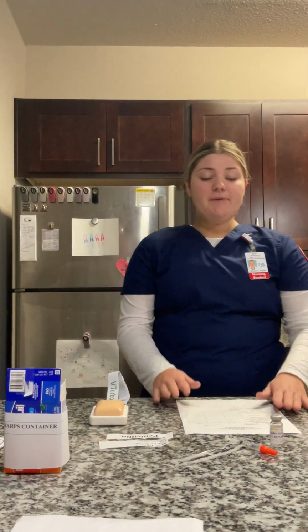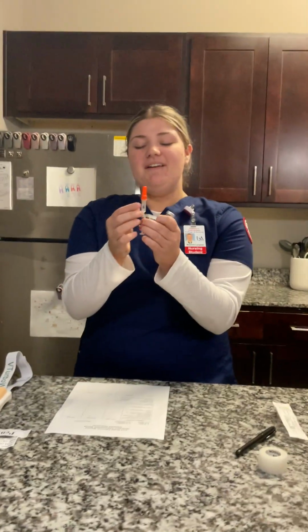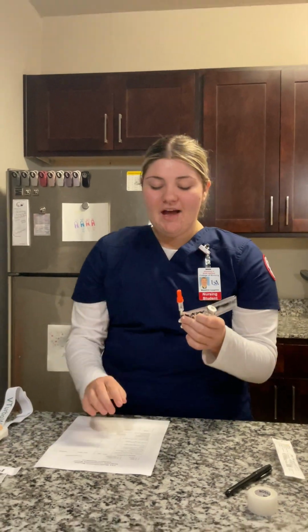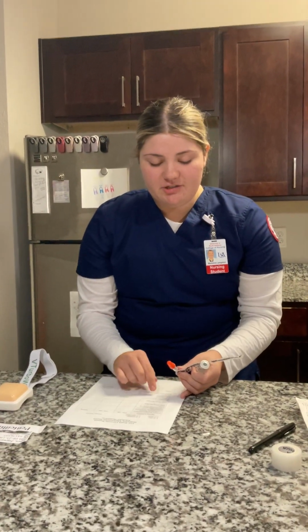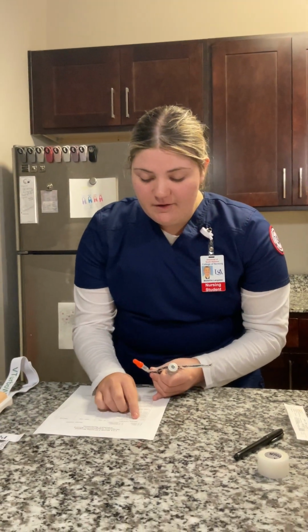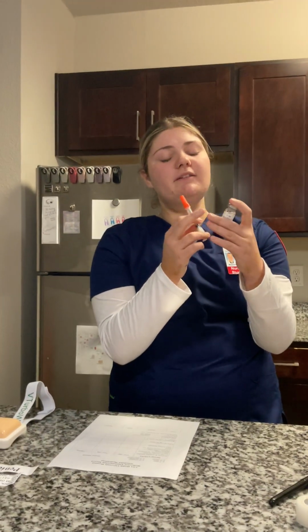So now I'm going to do my last check. I'm going to get my vial, my insulin, my syringe, and my MAR. So I'm going to look. It is for Jaguar J. Jones, and it is Novolin R regular insulin. It says on my label that it's Novolin R regular insulin, and on my vial, Novolin R regular insulin.